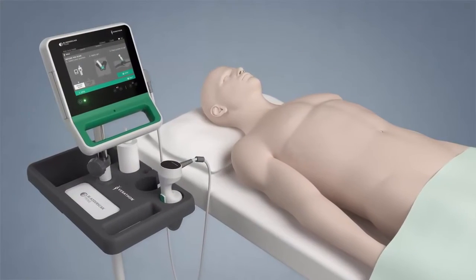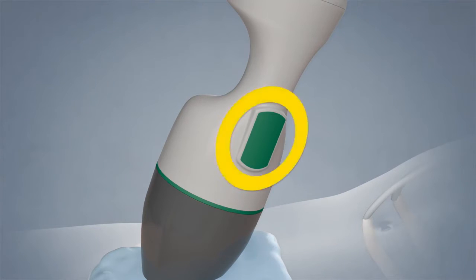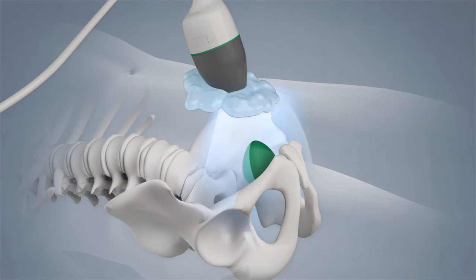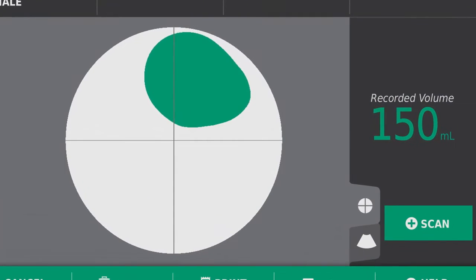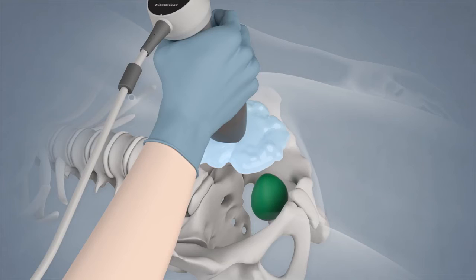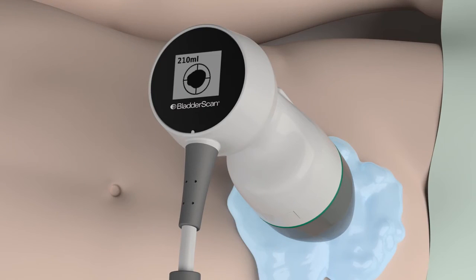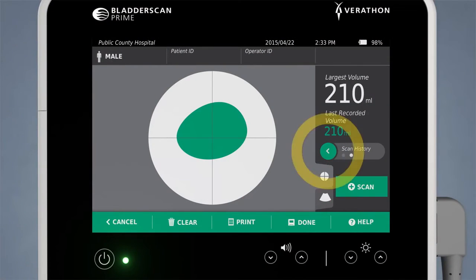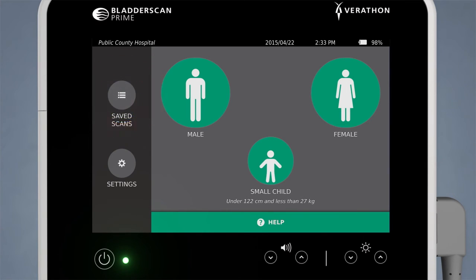Users who prefer post-scan aiming guidance can rely on BladderScan's proven C-Mode display. Simply begin a scan as before — press and release the scan button. When the scan is complete, the screen displays the result. If the aim is off-target, the bladder image appears outside the aiming crosshairs on both the monitor and the probe. Reposition the probe and scan again. You can press the volume measurement icon to view all scans in the series, and you may also print the scan result. Press the done button to save the peak volume scan in the series. You can also review saved scans from the home screen.